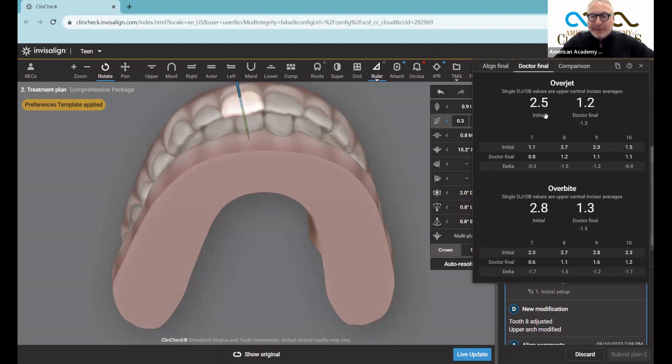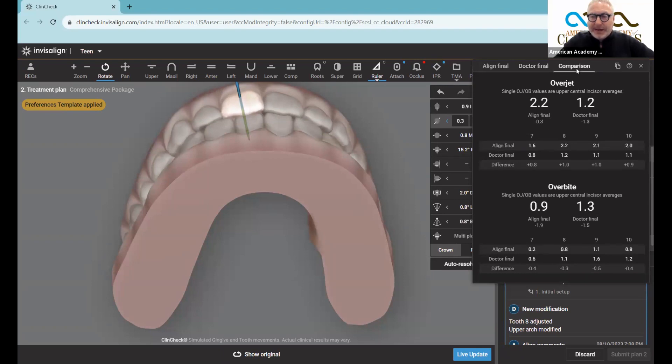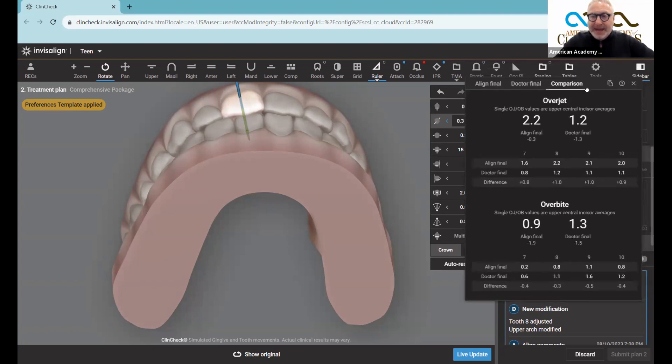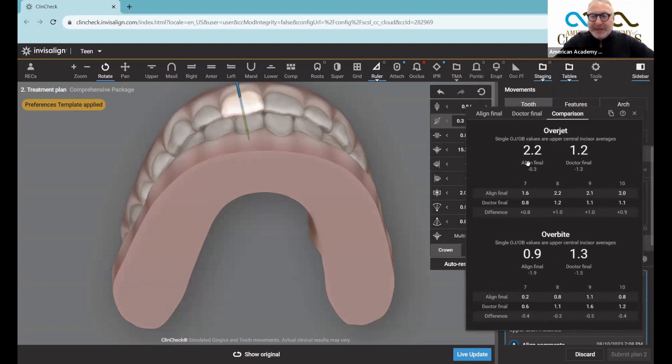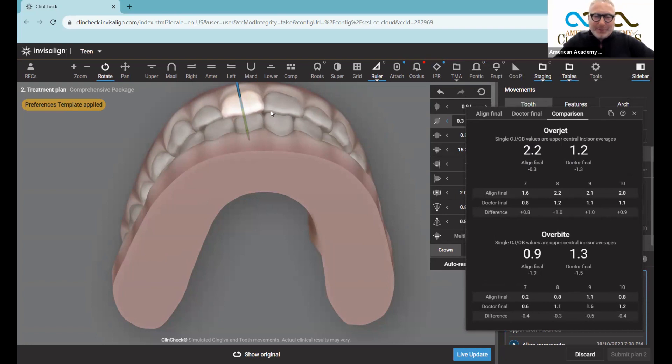So I always like to look and see what the initial overjet was and what the doctor final overjet was, and you can kind of compare it like that. This Invisalign created an overjet that was 2.2, I created an overjet that was 1.2. I don't want to actually do that because it'd be an edge to edge bite, but just wanted to demonstrate the point.